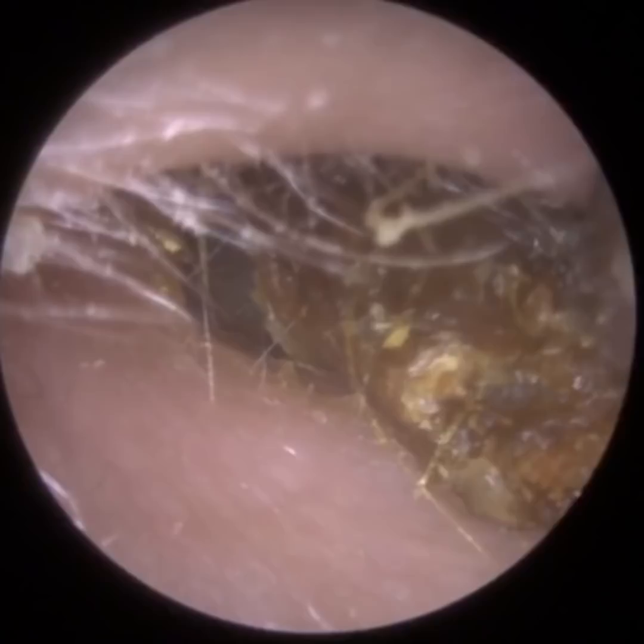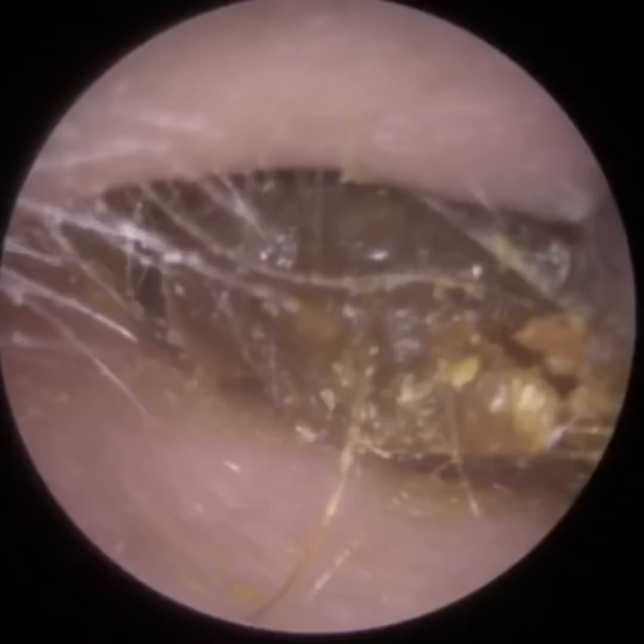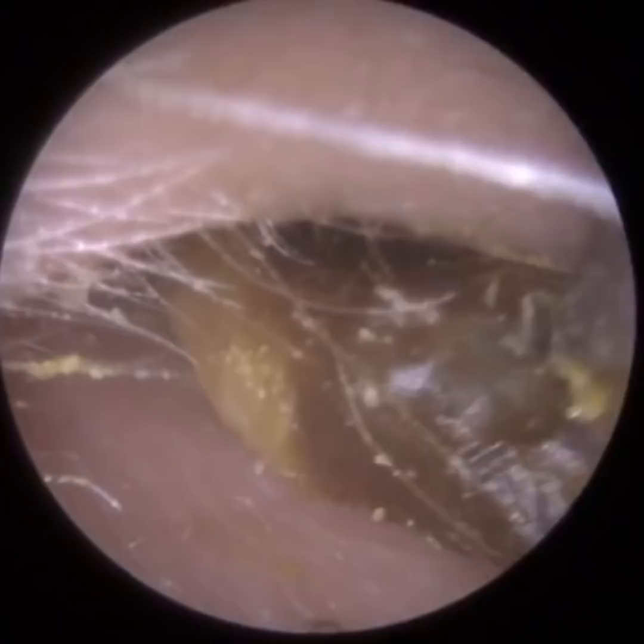When we remove the skin plug and keratin plug you're seeing here, the patient still remarked that they felt blocked — that's because the eardrum itself was coated with a layer of oil sitting on it. So there's that plug, and when we re-enter you can see all this wet skin and keratin.